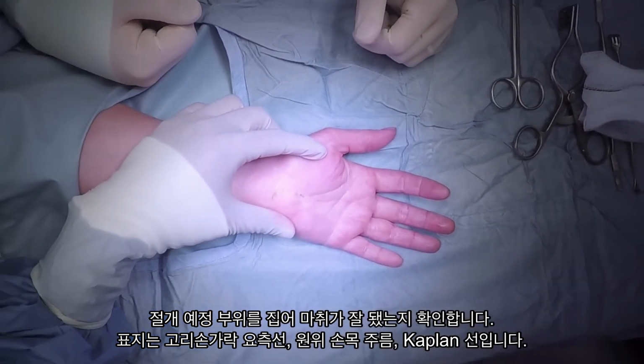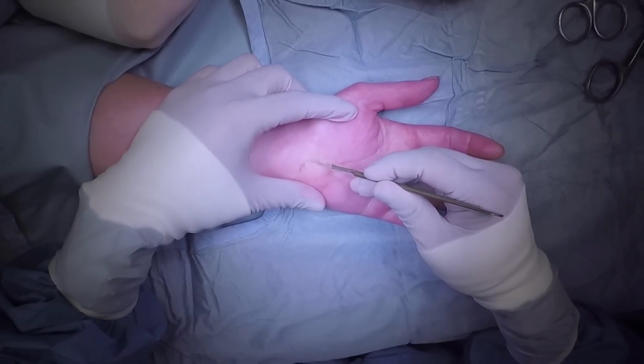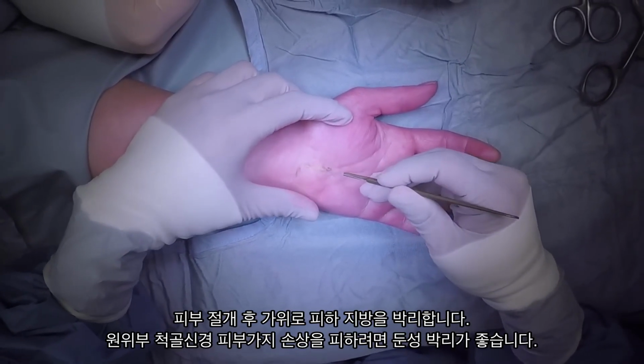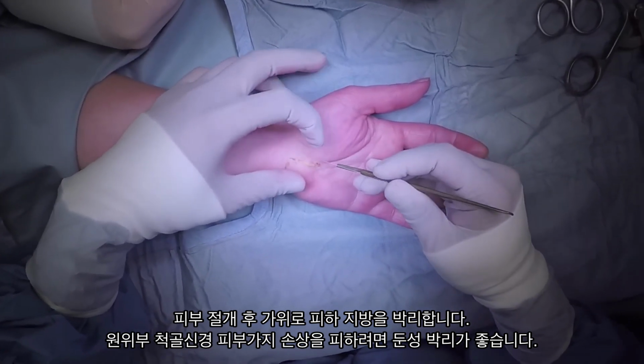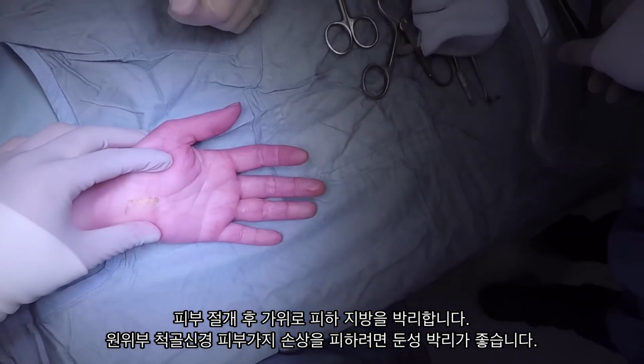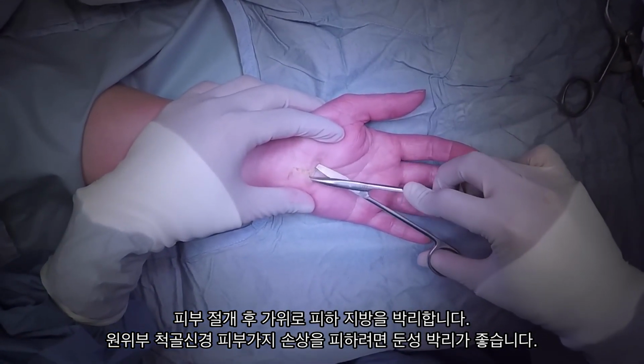Remember the landmarks for your incision, in line with the radial border of the ring finger, from the distal wrist crease to Kaplan's line, and avoiding the temptation to put the incision in the thenar crease. You're going to use a 15 blade for the whole procedure. After you complete your skin incision, use dissecting scissors to dissect through the subcutaneous fat. Remember, there may be a crossing sensory branch of the ulnar nerve distally, and the blunt dissection will help avoid injury.